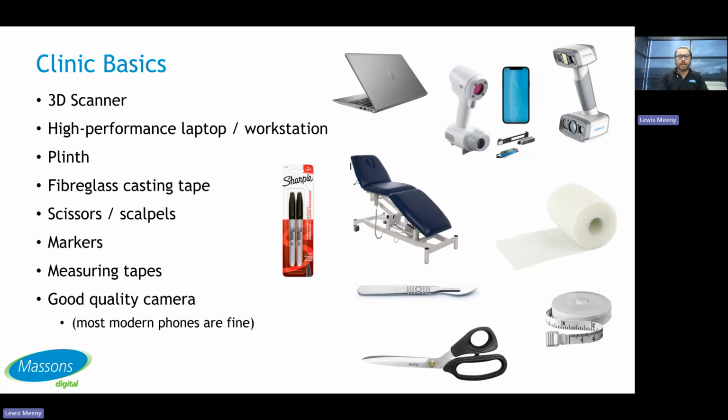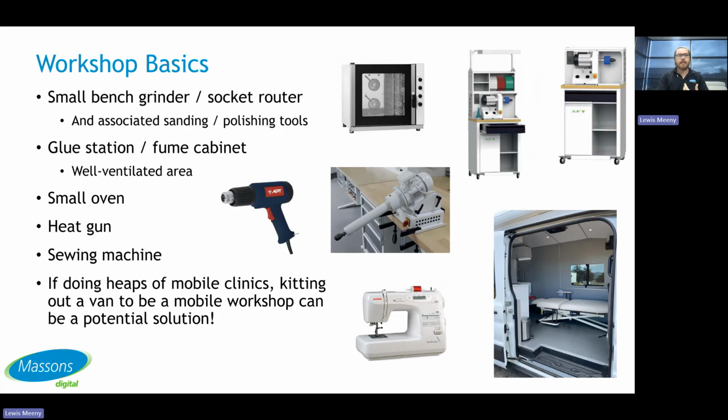Most modern phones are fine, but especially when you're starting with digital workflows, having photos as reference is always really useful. When it comes to workshop basics, a small bench grinder or socket router and associated tools to trim up the edges is going to be necessary. So there can be some standalone units or small bench mounted ones, but you're going to need some kind of grinder.